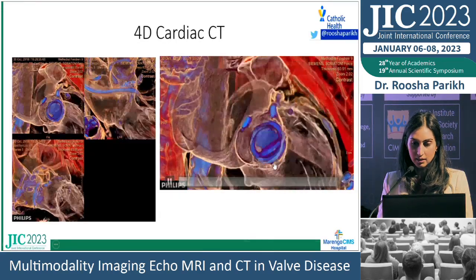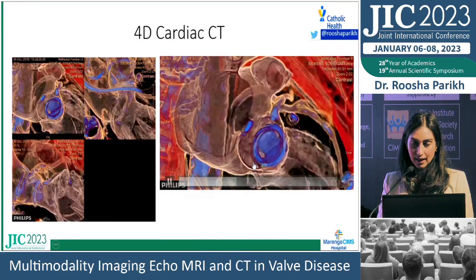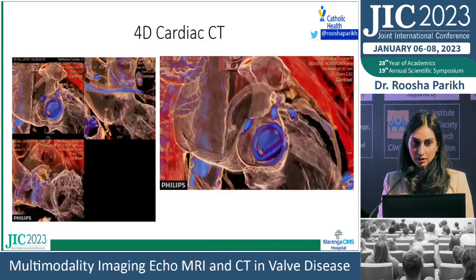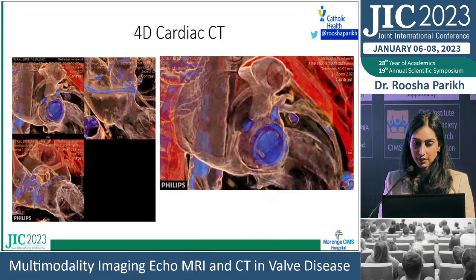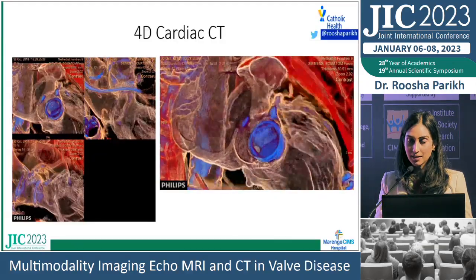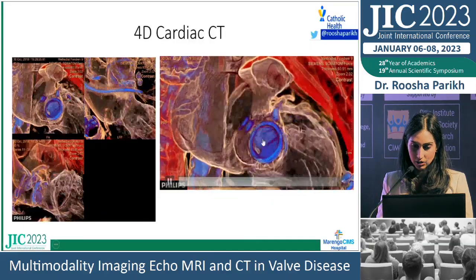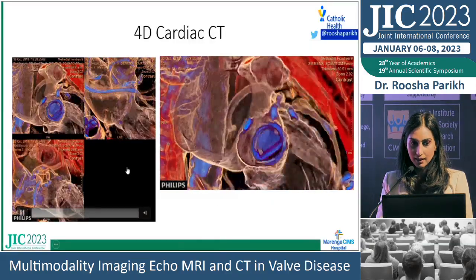And this is on a Siemens scanner. It's a good machine, but it's not even the latest technology. This is now a technology that's 15 years old. Again, these images can be post-processed to look like this, and here you can see this thrombus very clearly.